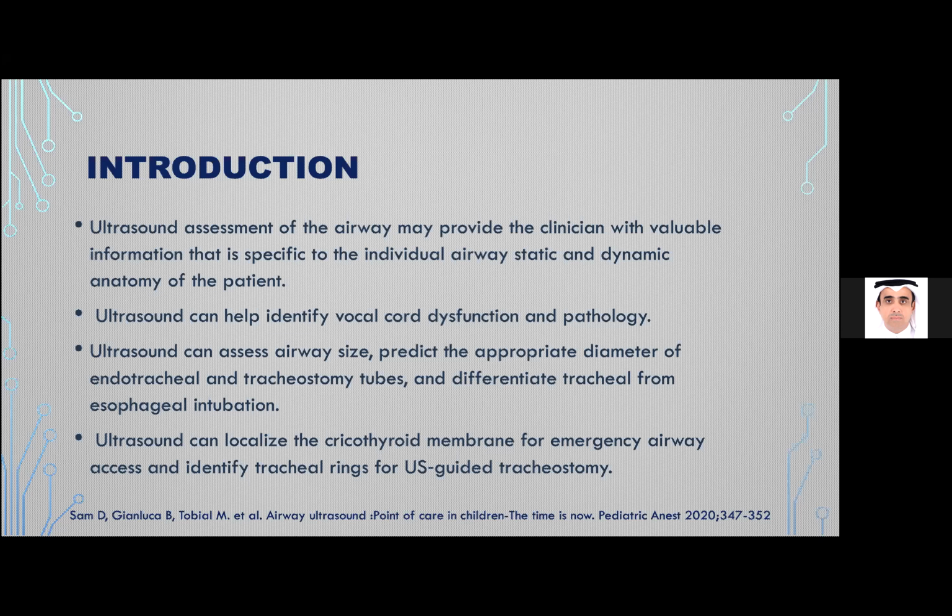You will do a good scan of the infrahyoid region to visualize the trachea and vocal cords. It's very important, a very crucial anatomical structure. You have to visualize it and be ready for any bad scenario, so you will see if there is any abnormality. In this view, this is the larynx, and you can see the thyroid cartilage. This is the thyroid cartilage. You can see the artifact for this one.